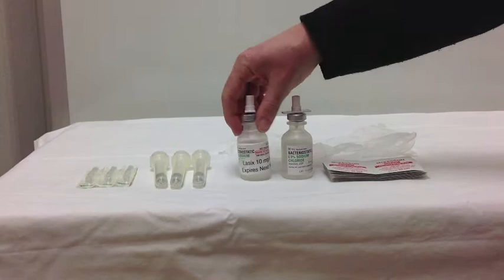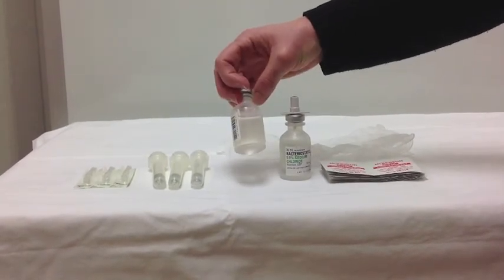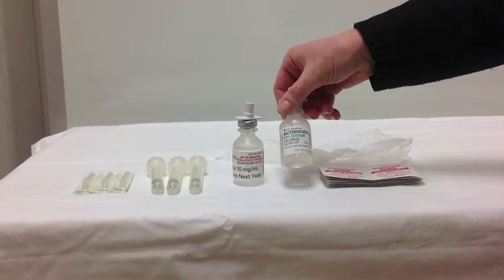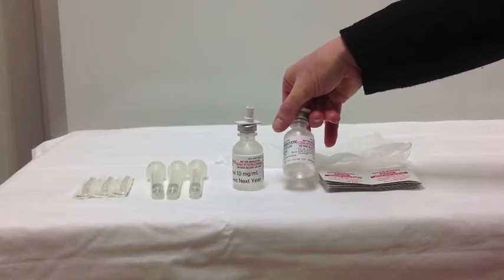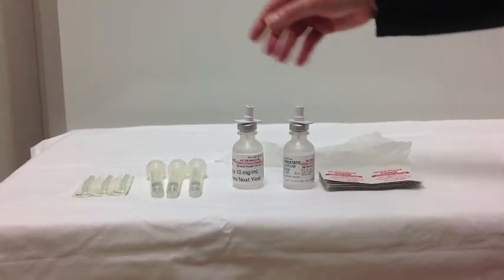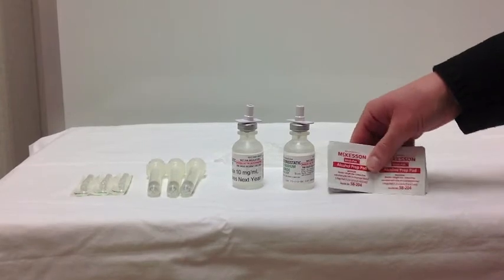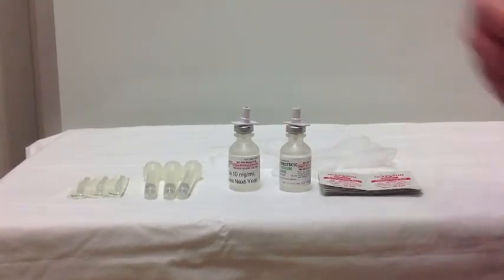So I have my Lasix 10 milligrams per ml, which expires next year, and I notice that the vial is clear and there are no particles floating in it, so it looks good to use. I also have normal saline, 0.9%. It expires in November of 2018. And the fluid is nice and clear in this vial as well. I also need my 3 blunt cannulas, my 3 ml syringes, and a stack of alcohol wipes, as well as some clean gloves for the procedure.